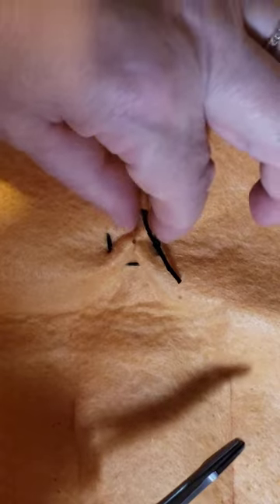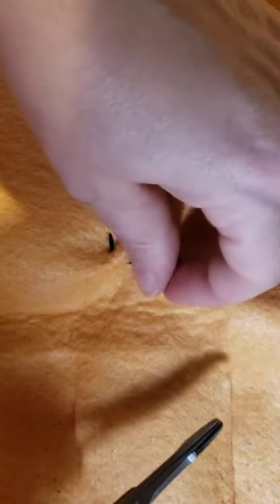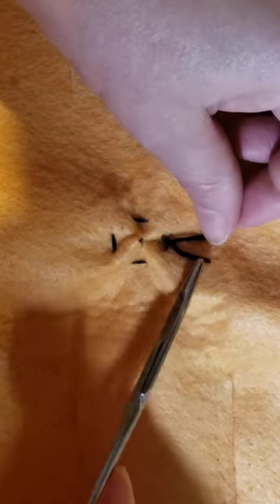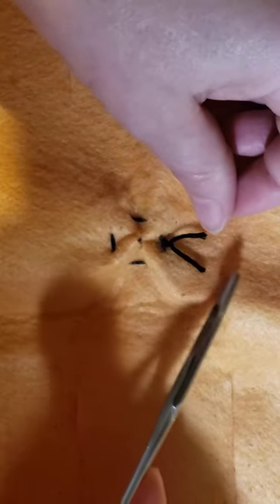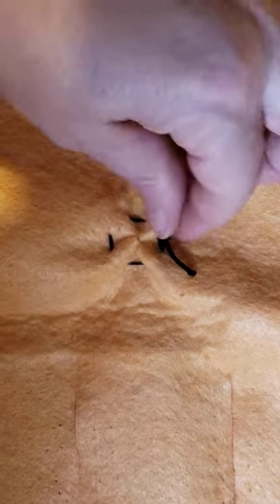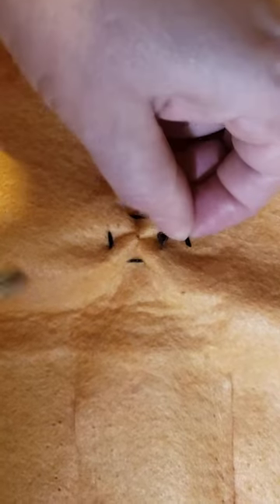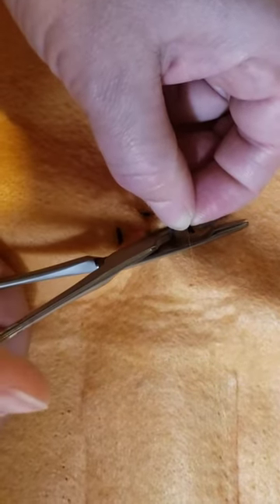Now, if this is a knot that you're going to be removing, you want to make sure you put some sort of note, a piece of tape or something, onto your patient so that you remember to remove your purse string suture. Okay, I'm going to pull those off so that you can see. You can see how it's cinched up the hole. You have your knot and you have your two little tags. You can leave these tags long enough that you can go ahead and grasp them so that you can remove them. But you want to make sure that they're not too long.